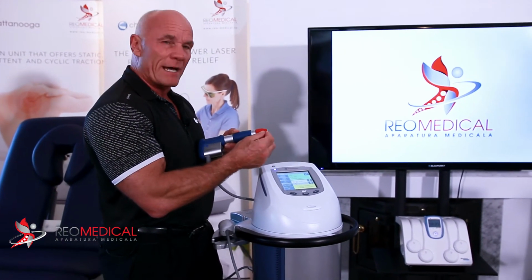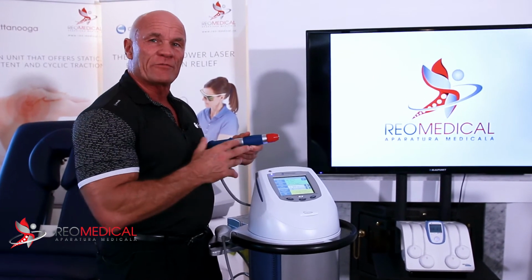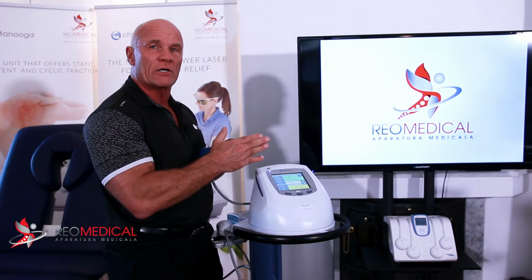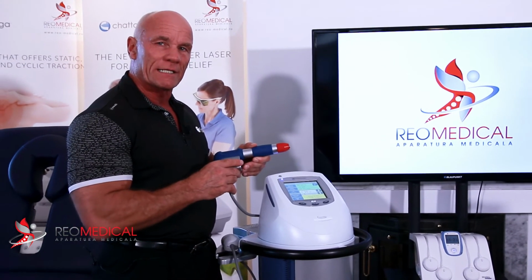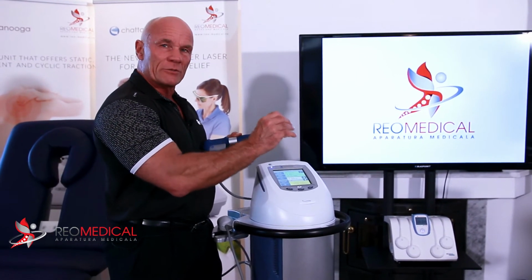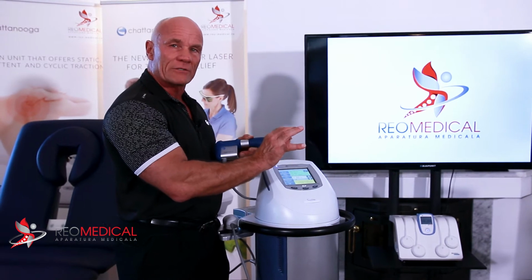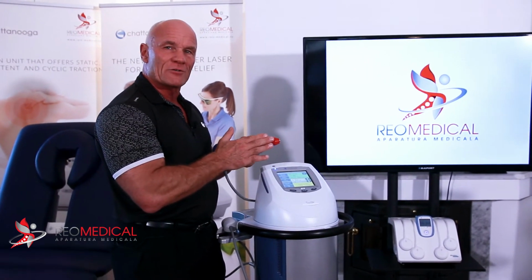Because it's the amount of energy coming out of the transmitter, which is referred to as the energy flux density, the EFD. And this is what's quoted in the literature. It's that EFD that's having the therapeutic effect and the physiological effect on our patient's tissue. So this is the most important thing to look at.